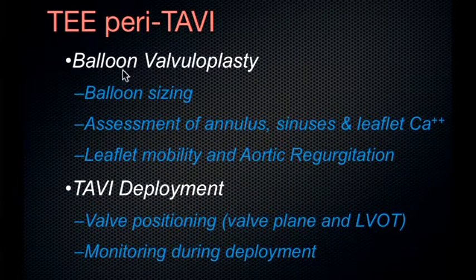During the balloon valvuloplasty, we can get some estimate of the balloon size relative to the annulus, and some centres believe that this can help them in deciding valve size. But more particularly, I like to use the balloon valvuloplasty with TEE to assess the annulus, sinuses and the leaflet calcification, and to see how the leaflets behave when the balloon is inflated. And I'll show you some examples of that.